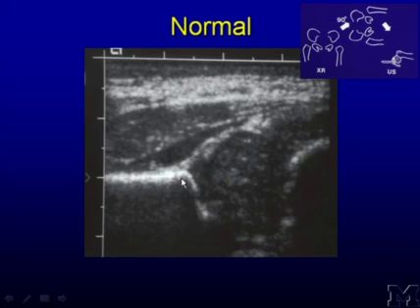This is the osseous acetabular roof. This would be seen on an x-ray as well. This is the lateral aspect of the ilium. These are gluteal muscles coming around, and you can see indeed the ball is within the socket, as you see in this picture.